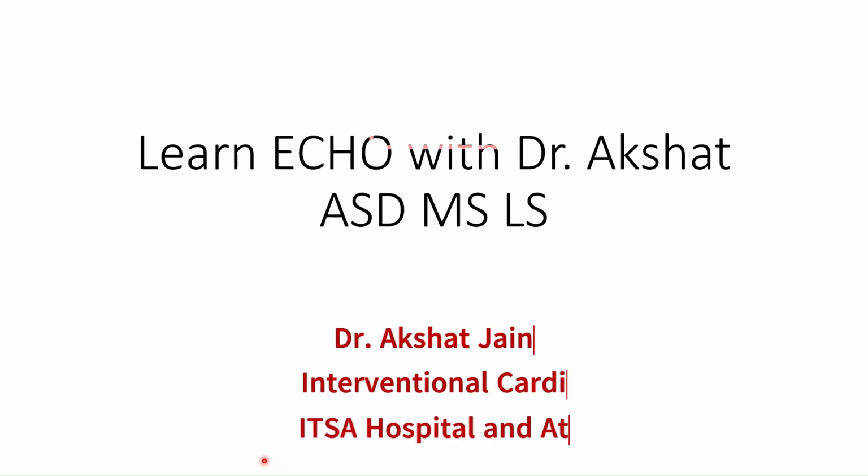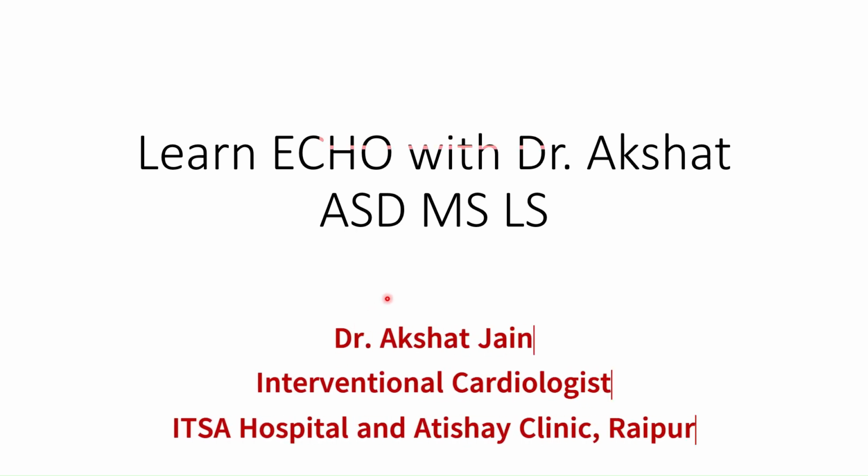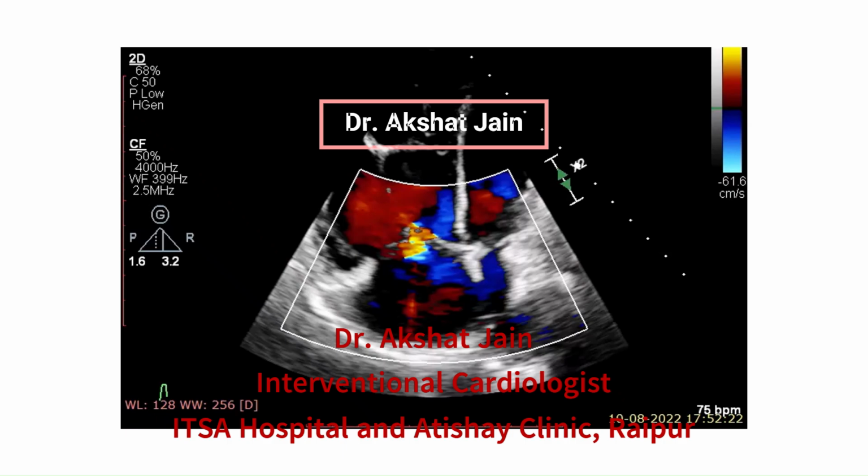Hello everyone. So today we will go through echo findings of three diseases, that is atrial septal defect, mitral stenosis, and the Lutembacher syndrome, which is coexistence of atrial septal defect with acquired mitral stenosis. We will also discuss in brief about their clinical presentation.